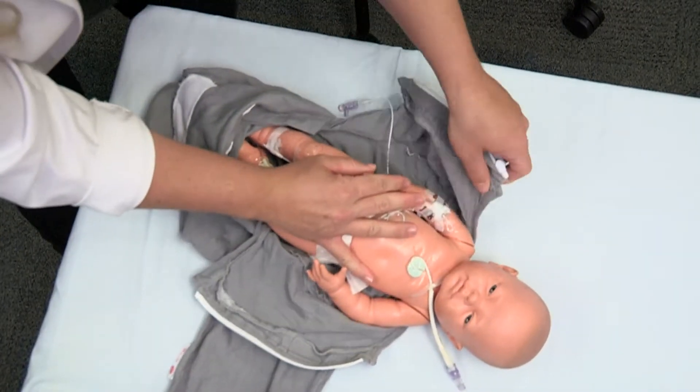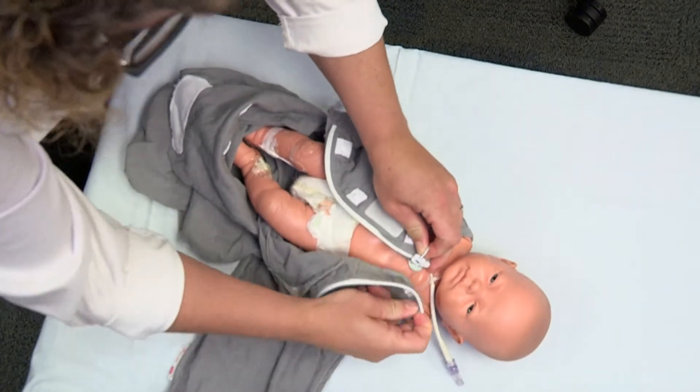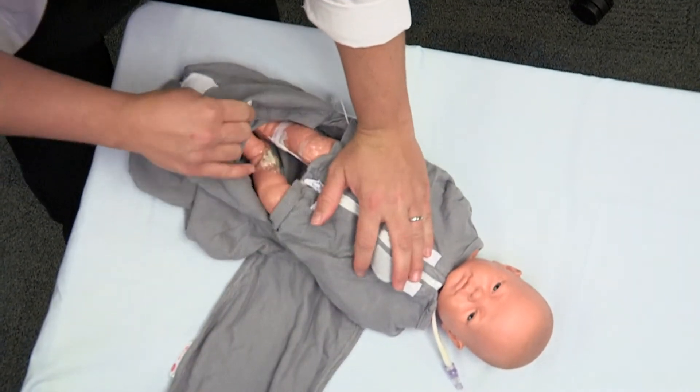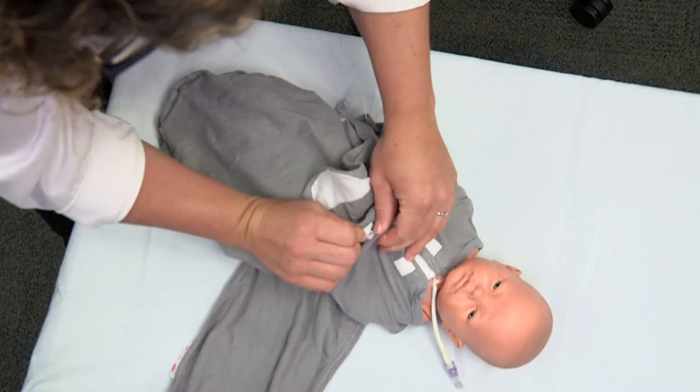First, ensure the arms are down and across the chest. Ensure that the zipper locks in and begin zipping downward until closed. Place lower extremities into the leg pocket, pull tab up, snap closed, and then Velcro.